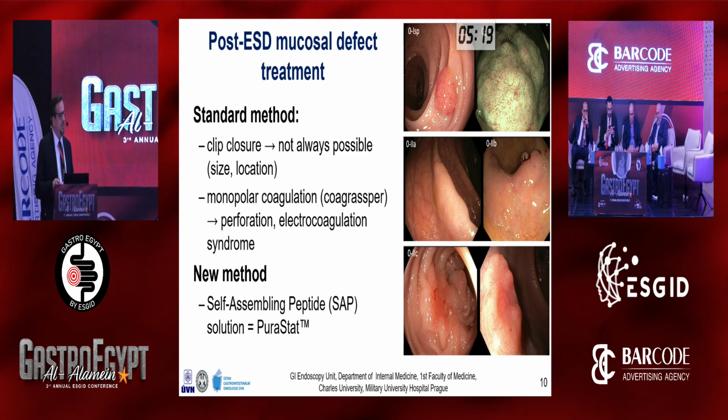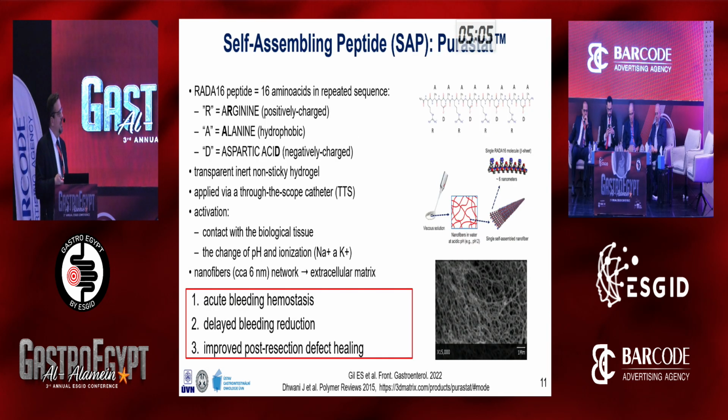So coming to the future, I need to mention the post-ESD mucosal defect treatment. This is what I do. This is my expertise. What I did previously was clip closure or monopolar coagulation, but now we are using the self-assembling peptide solution, as you can see here.